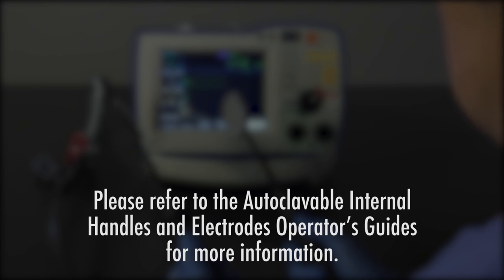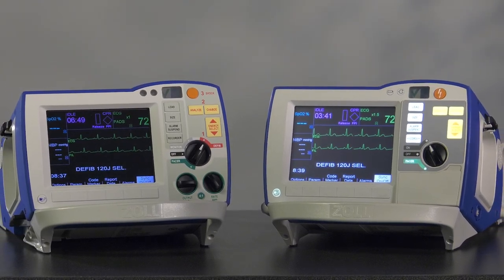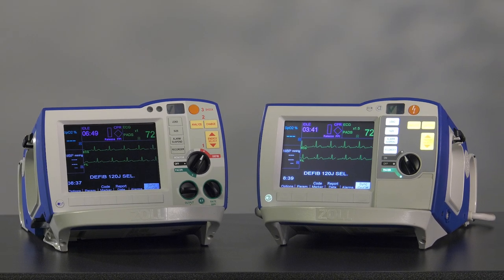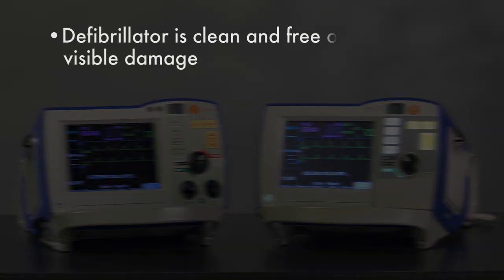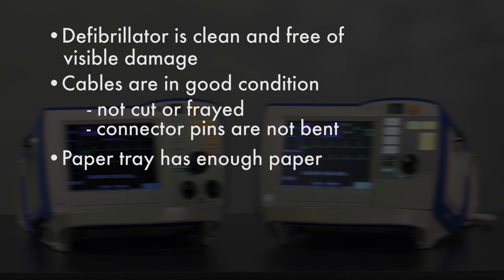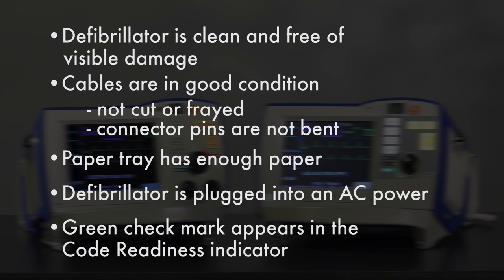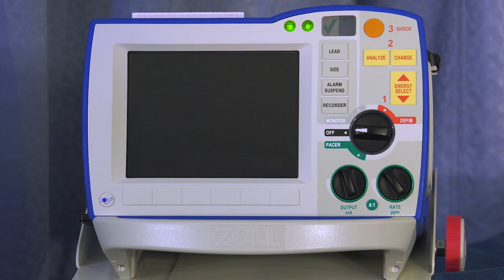Please refer to the autoclavable internal handles and electrodes operators guides for more information. In addition to the automatic testing of the R Series, Zoll recommends that you perform a daily visual inspection of the device. During this inspection, check that the defibrillator is clean and free of visible damage, that the cables are in good condition and not cut or frayed, and that the connector pins are not bent, that the paper tray has enough paper, that the defibrillator is plugged into AC power, and that the green check mark appears in the code readiness indicator. The readiness dashboard presents several visual indicators that quickly provide the status of the defibrillator.